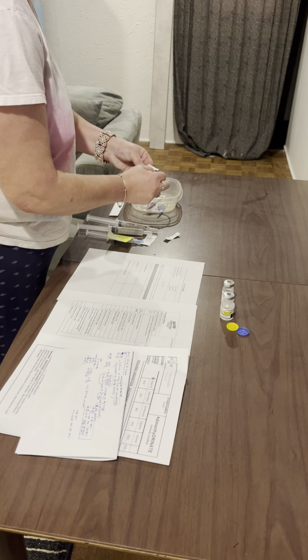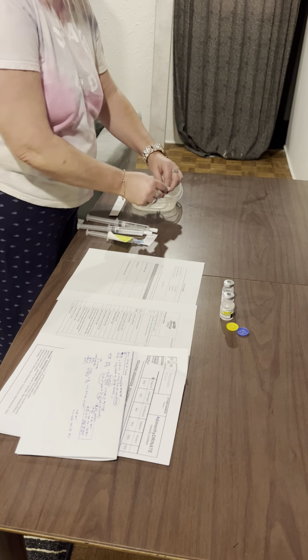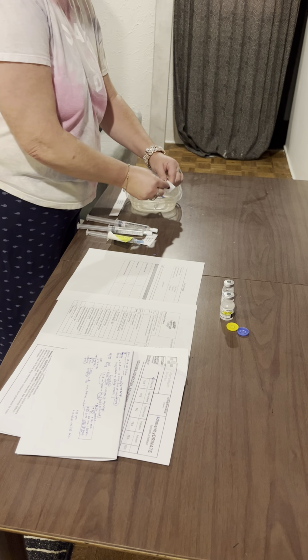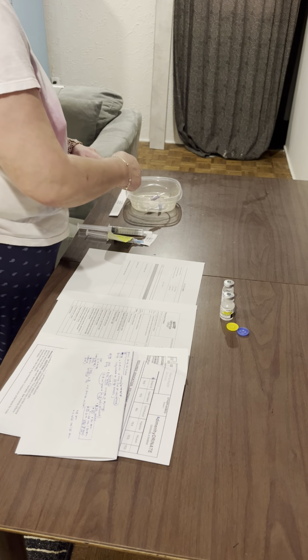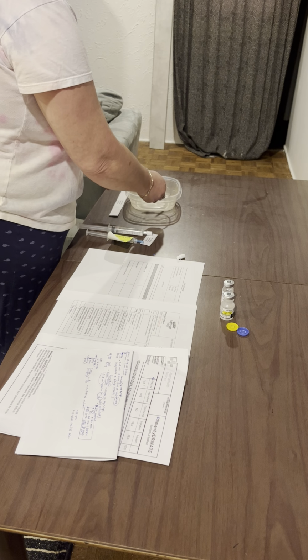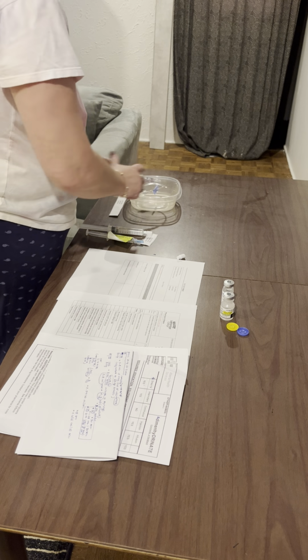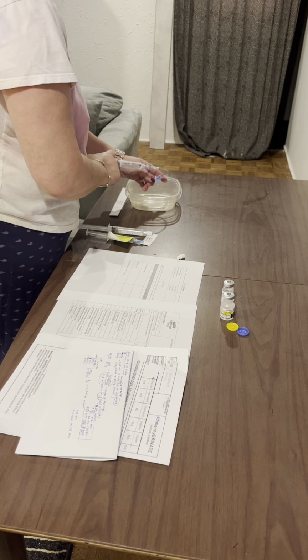So I'm just going to take an alcohol swab out here, and we're just going to clean the port. Give it a good scrub. Okay, we've cleaned the port. That's great. Okay, so the first thing we're going to do is flush. This initial flush is just to check the patency of the site. So this one we can just unlock the saline lock here.